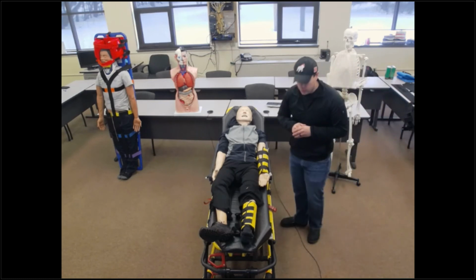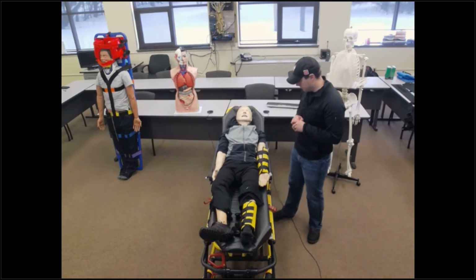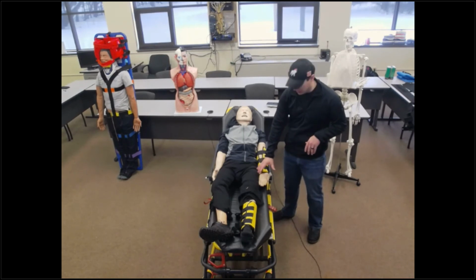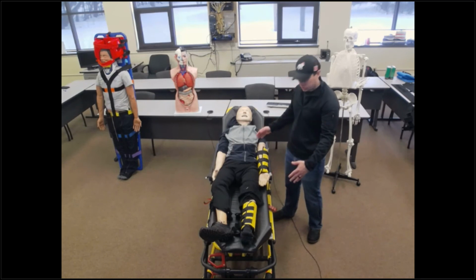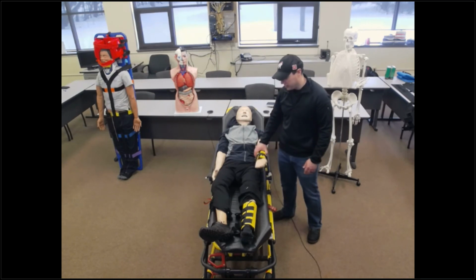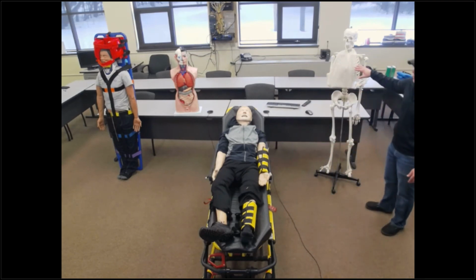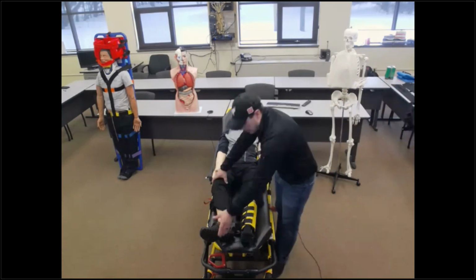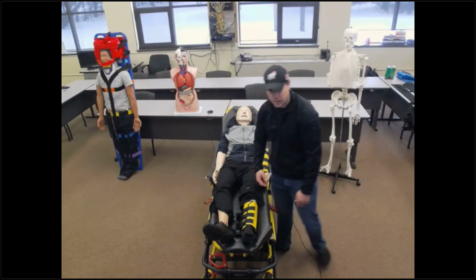So remember too, as far as securing the patient above and below that specific joint. With the wrist, that's a joint, so it's secured relatively above and below with this splint, same with the ankle. But anytime that we have a larger surface area, and every time we're splinting the arm, go ahead and utilize our sling and swath technique here to ensure that that arm is not moving around. And then I can go ahead and also tie the patient's legs together too. And that way I'm securing more and more. And I can do that with a triangular bandage or a couple of triangular bandages.